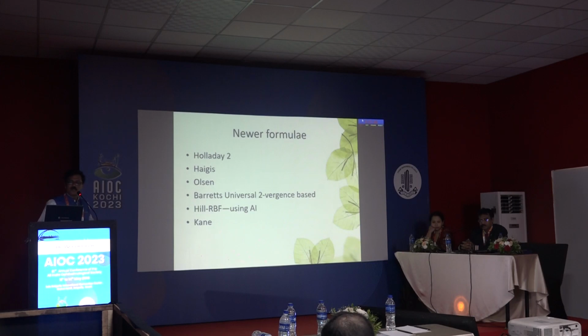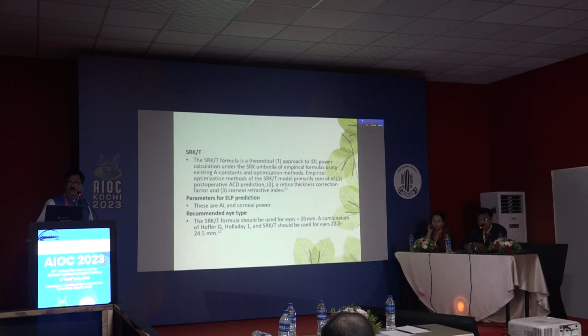These are the newer formulas: the Holladay 2, Haigis, Olsen, Barrett's Universal 2, Hill RBF and Kane. Many of them are available online. You can just go online and use them, and the results are definitely much more accurate. For the newer formulas, in addition to axial length and keratometry, you need the lens thickness as well as the anterior chamber depth. So these parameters are also required.